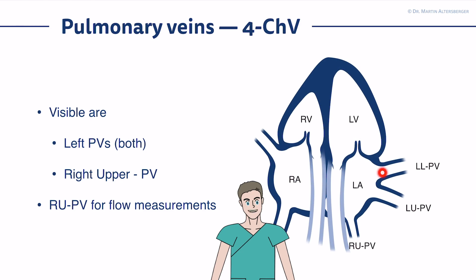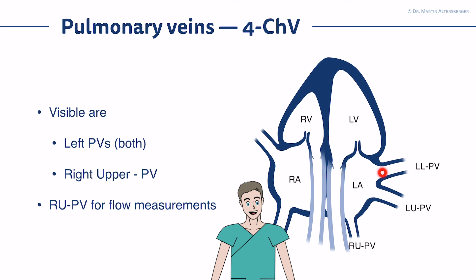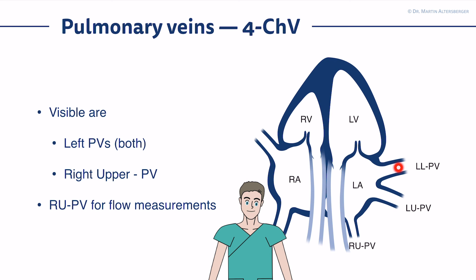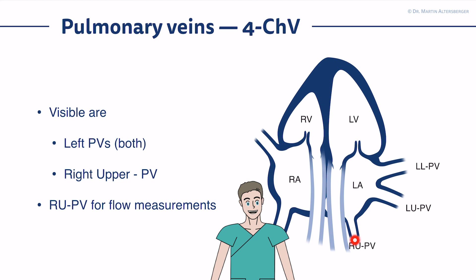Some structures I want to mention because they are important to visualize are the pulmonary veins. They are not always easy to find, but with better machines it becomes easier. In a normal anatomical setting, the left pulmonary veins — left lower and left upper — can be seen, but measurements make less sense compared to the right upper pulmonary vein, where beam orientation is optimal. The right lower pulmonary vein in TTE, from my experience, is not possible to find.